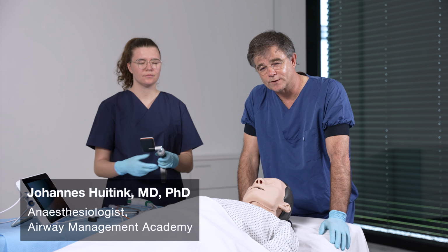Today I would like to show you a trick with dual cameras. It's a dual camera technique called VAFI, Video Laryngoscopy Assisted Flexible Intubation. And we will start in the intensive care unit.